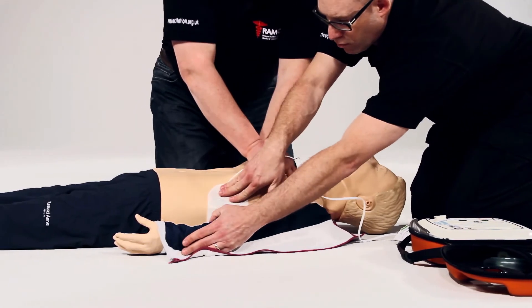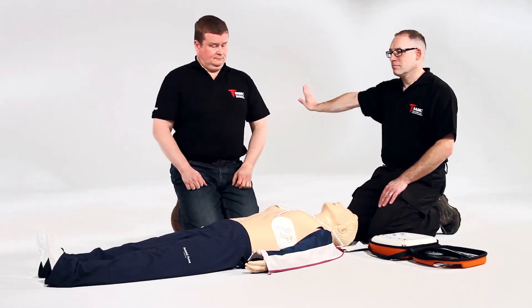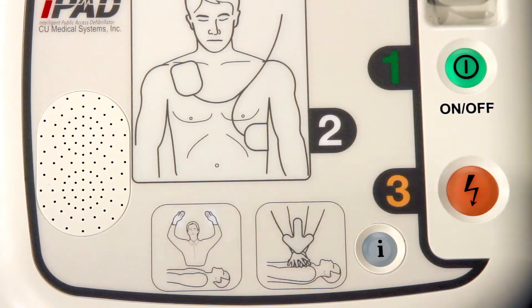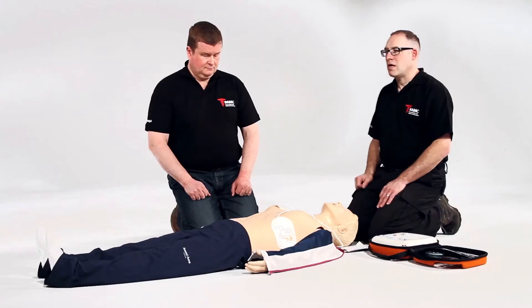Do not touch the patient. Analyzing heart rhythm. Stand clear. Shock advised. Stand clear. Press the flashing orange button now. Deliver shock now. Stand clear. Shock delivered. Carry on.